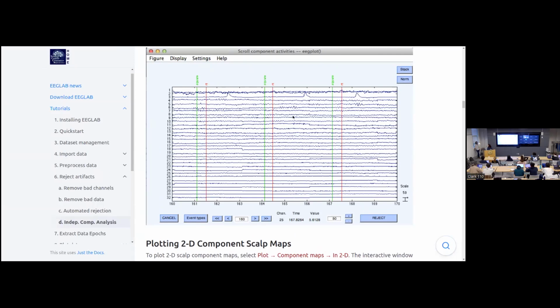What's the classification, so reducing dimension? Yeah. So in EEG data, you get time series data. You have data that comes with a time context. It's a stream of data, and within the stream of data you can look for these artifacts. So it looks like a spike that's making a blip.